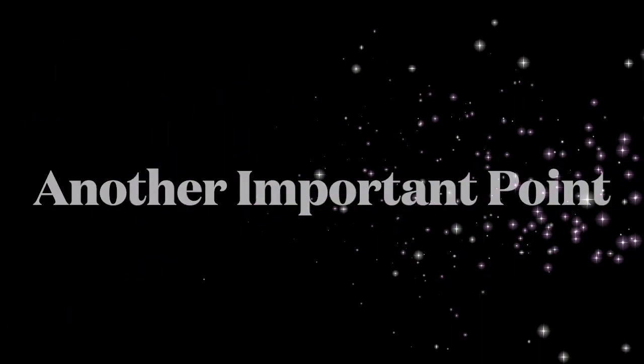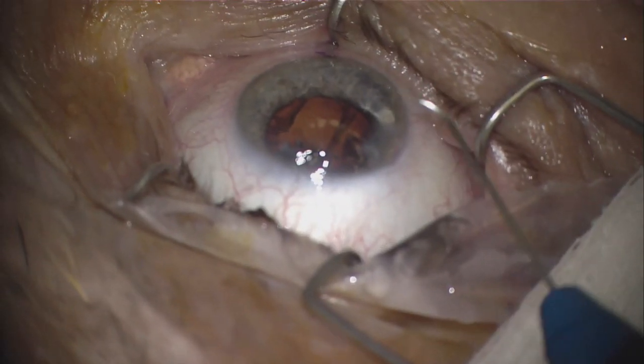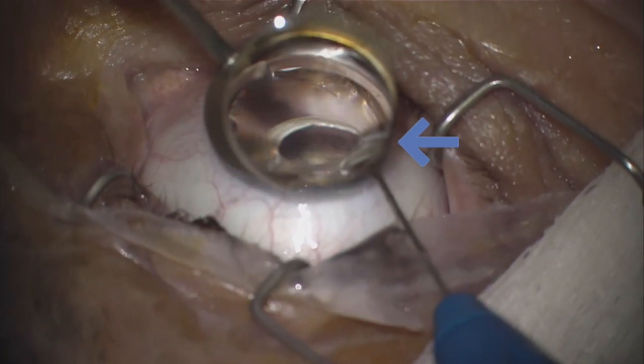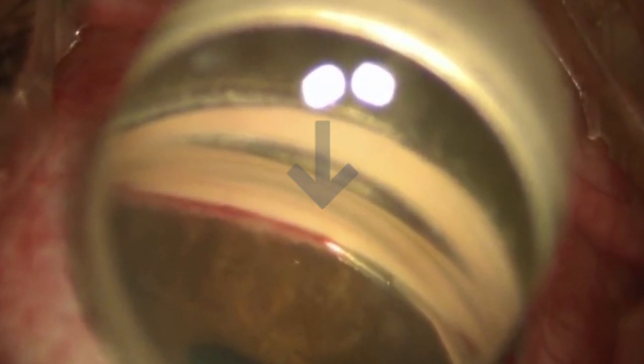Another very important point is that when implanting the Hydrus Microstent, it is vital to select the proper entry target. The best location is 3 to 4 clock hours away from the non-radial corneal incision being used for the entry of the stent. This will allow for the curvature of the stent to glide easily in the angle.